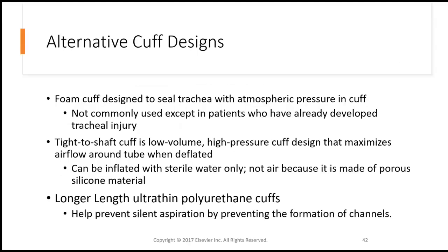There are several alternate cuff designs out there. Specifically, your book talks about foam cuffs. These are designed to seal the airway using just atmospheric pressure in the cuff. So it's just foam that seals off the airway. These are very, very uncommon. You really won't see these a lot. I think I've maybe seen 3 or 4 patients in my entire career that have had foam cuffs. That's because these are primarily used in patients who have already developed tracheal injuries. For somebody with an established tracheal injury, we might switch them to a foam cuff to avoid further exacerbation of the problems.